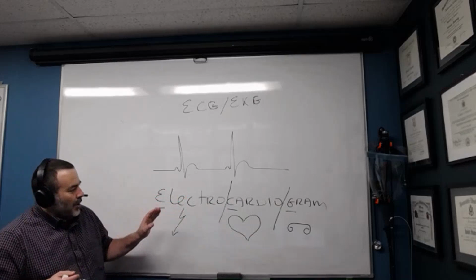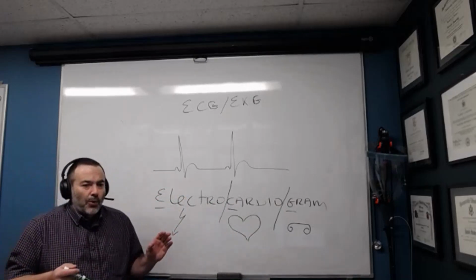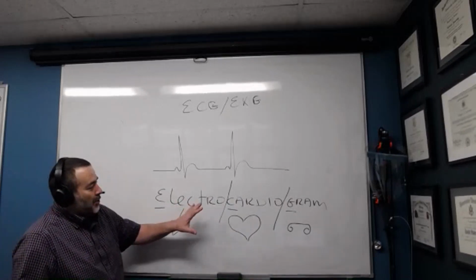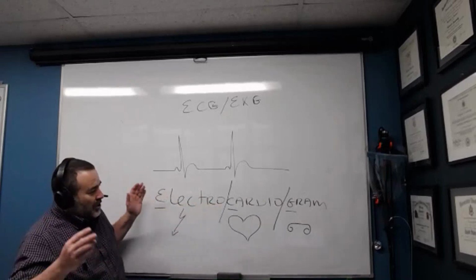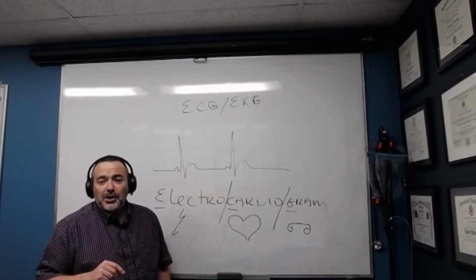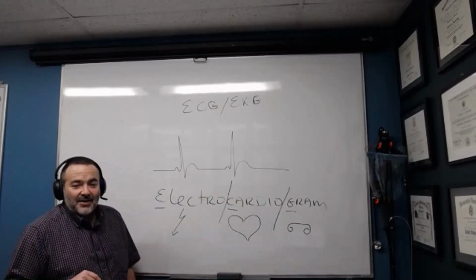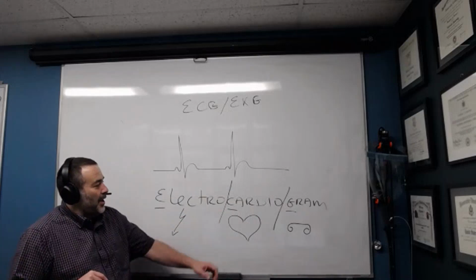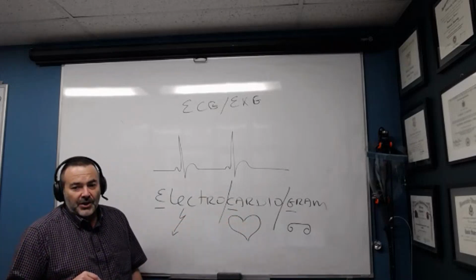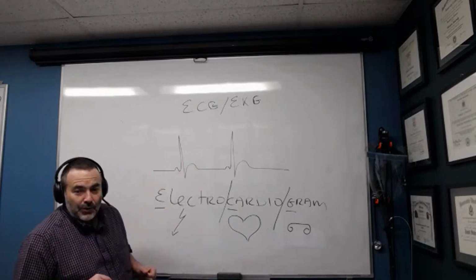Electrocardiogram. Yeah, it's a big word, and some people struggle to pronounce it. That's why it is most important to decipher the word, the medical term, make it smaller, because usually a large medical term is a bunch of small medical terms slammed together. In this particular case, this is how you can memorize it. Recording of heart's electrical activity. Definition of electrocardiogram. Now, how does it translate into this?